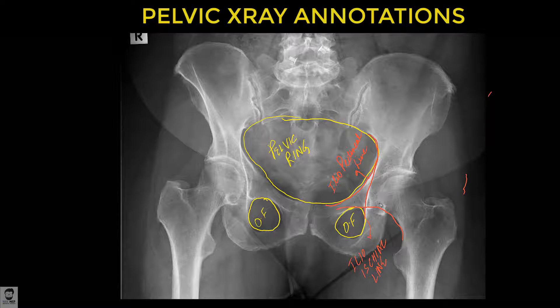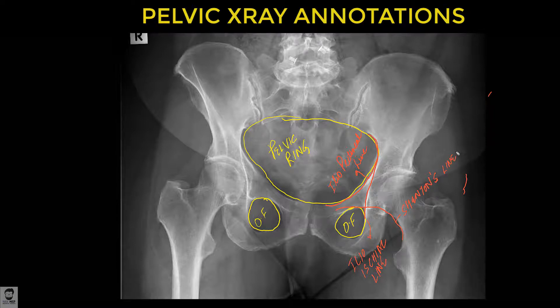These are two important lines to understand. Then, continuing from the medial side of the femur with the pubic rami, you have Shenton's line. This is a very important line because in femoral neck fractures, as we will see later, this line is broken — and that's one of the key things to identify.